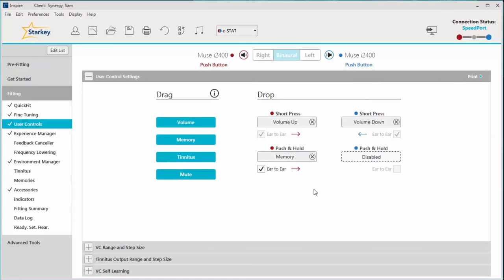You'll notice that the ear to ear box is now automatically checked, ensuring that my patient will be changing the memories in both hearing aids by simply pushing and holding the button on the right aid.